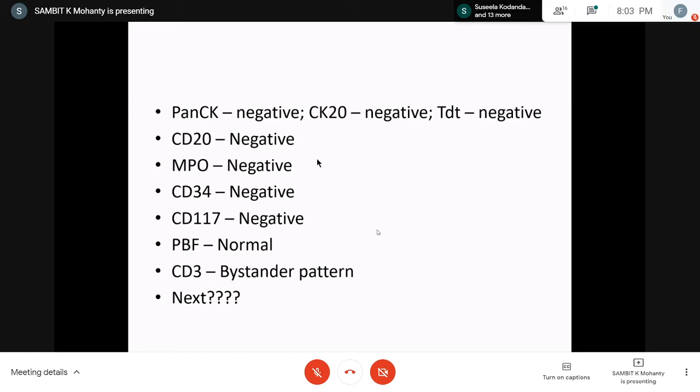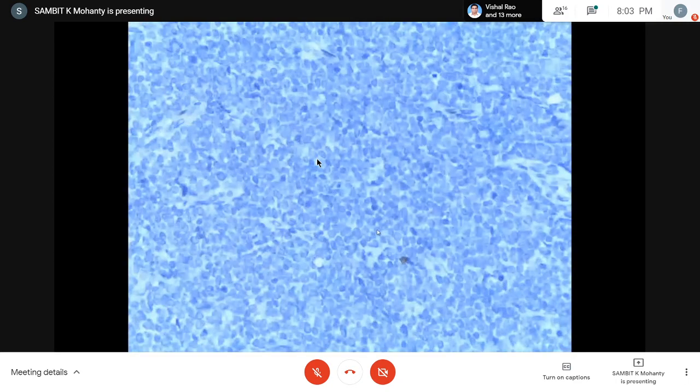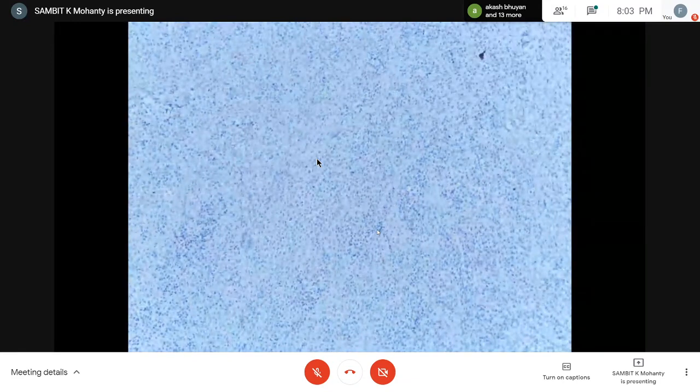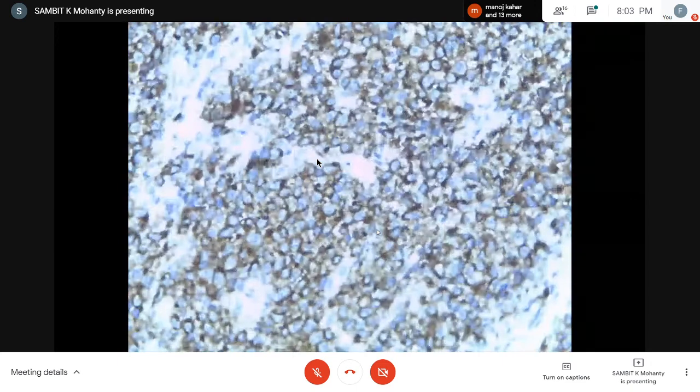Okay, great. You hit the point. I'll show you. This is the ALK. This is CD30. This is CD3. This is your CD20. This is BCL2. I'll show you the best ALK here. This is your ALK.